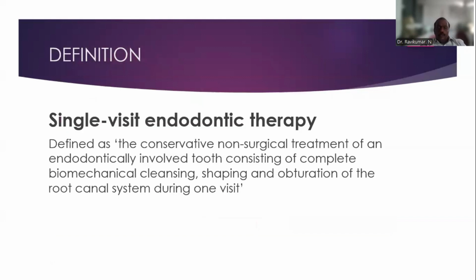All together, we do it in a single visit. It's called single visit endodontics. Single visit endodontic therapy is defined as the conservative non-surgical treatment of an endodontically involved tooth, that means a tooth with pulpal involvement, consisting of complete biomechanical cleaning and shaping and obturation of the root canal system in a single visit.